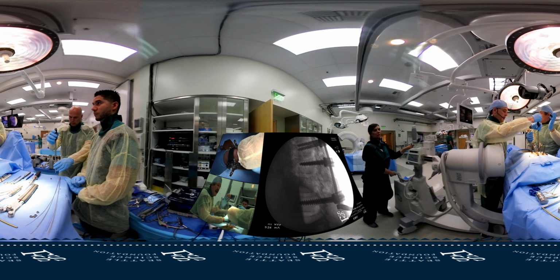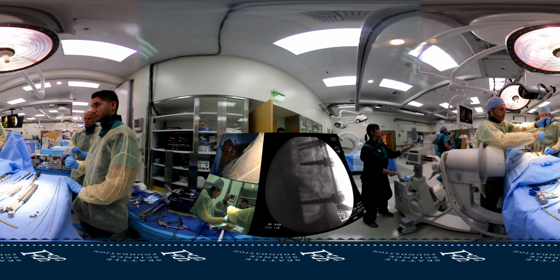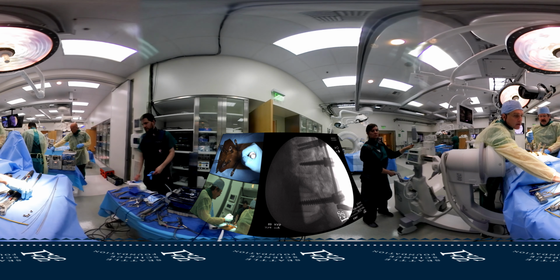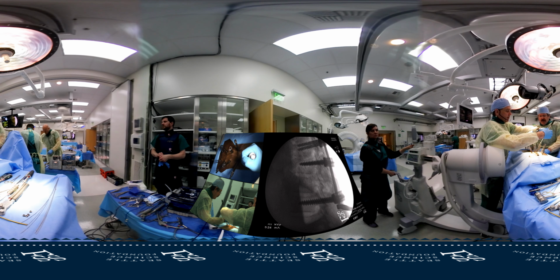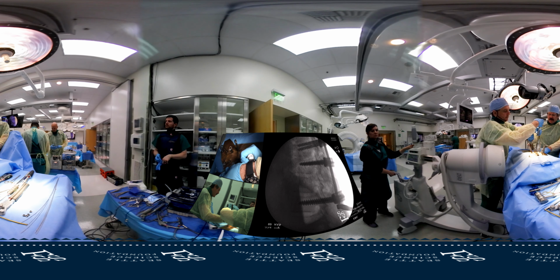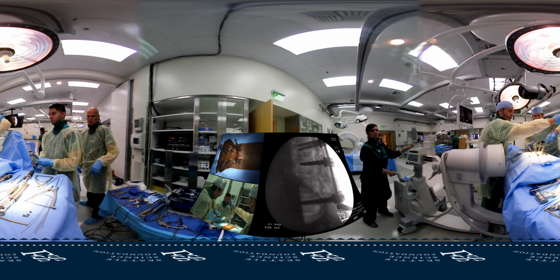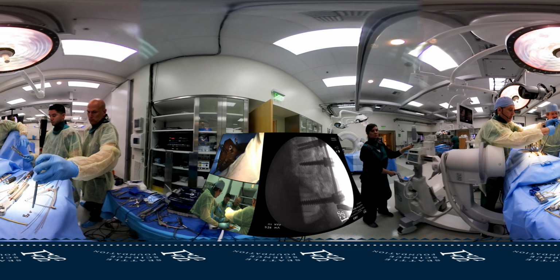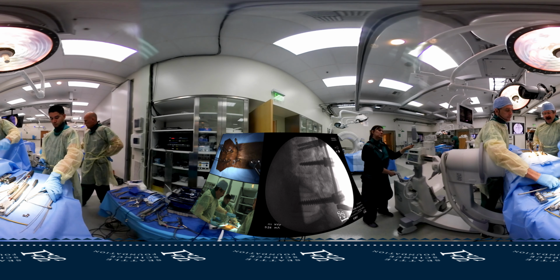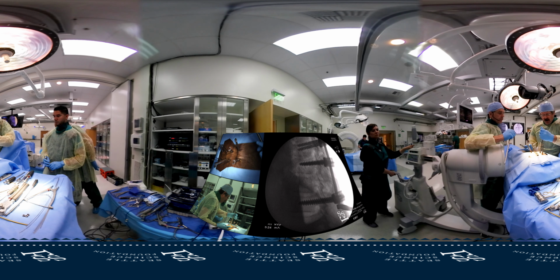So if this was an ankylosed spine, I would be good to go, and I would finish putting each of my screws in. Do you have the compression distraction thing? And then I'll show you a compression distraction technique, and then we'll be done. With my right hand, I'm holding my kyphosis in the proper direction so I stay aligned. And we'll tighten down each of the screws. And then once that one goes in, I can release the rod and I can torque, counter torque. So in this system, if I want to do any compression or distraction, those are tight. All the systems, again, I mean, this is just how this system works, but all the systems are a little different.